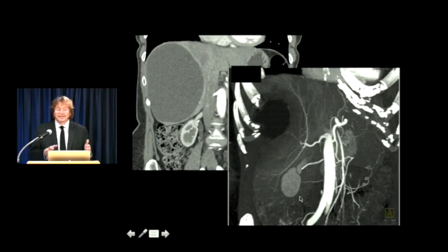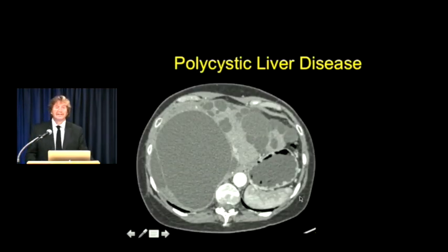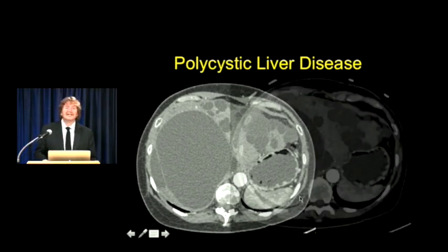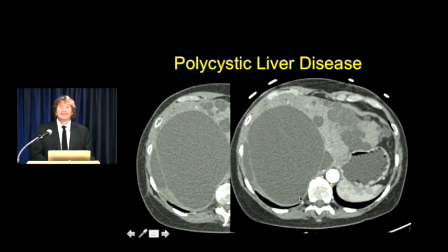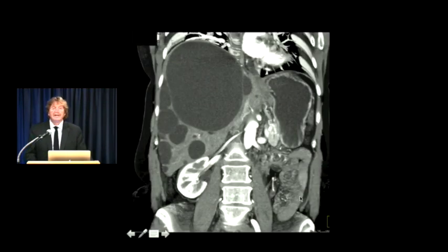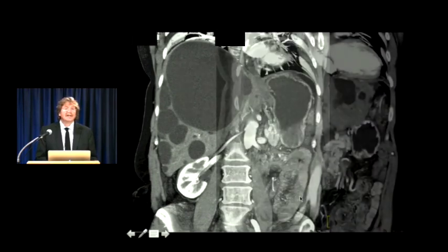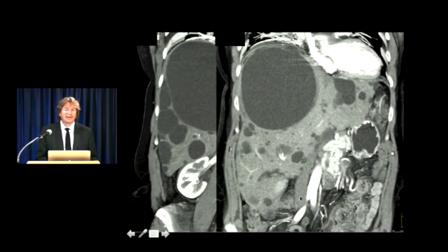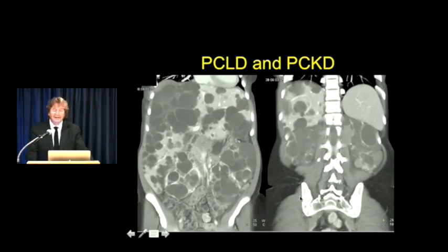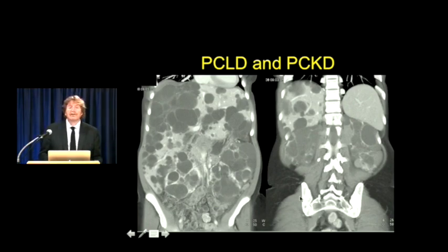When you have multiple cysts, that's polycystic liver disease. We talk about polycystic liver disease in the same breath as polycystic kidney disease - about half of patients have both. With polycystic liver disease, sometimes you have very large cysts and smaller cysts. They typically involve both lobes of the liver. Sometimes it's an incidental finding; sometimes patients present with liver failure when the entire liver is replaced by cysts. Here's an example with large kidneys from polycystic kidney disease and very extensive polycystic liver disease with some portions of the liver entirely replaced by cysts.